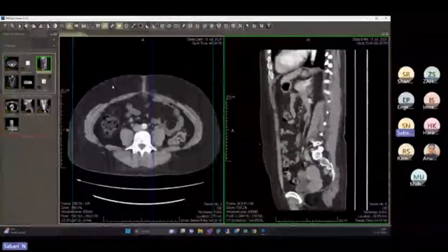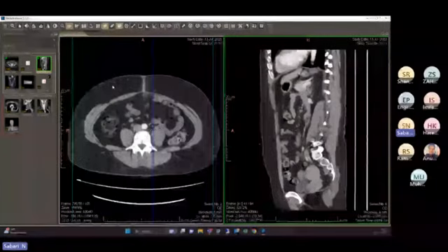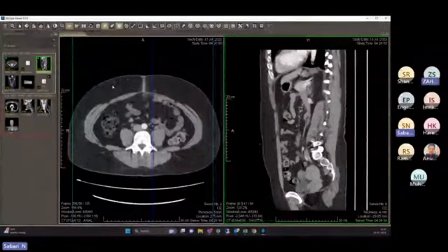You can buy a NAS box. A 12 terabyte NAS box will come roughly at 1 lakh or 2 lakh rupees in Indian money, with a RAID 5 configuration and hot-swappable hard disks. If one disk fails, nothing will happen. Even with one disk failure, your storage will still be accessible. It will give a notification alert: so and so disk has crashed.